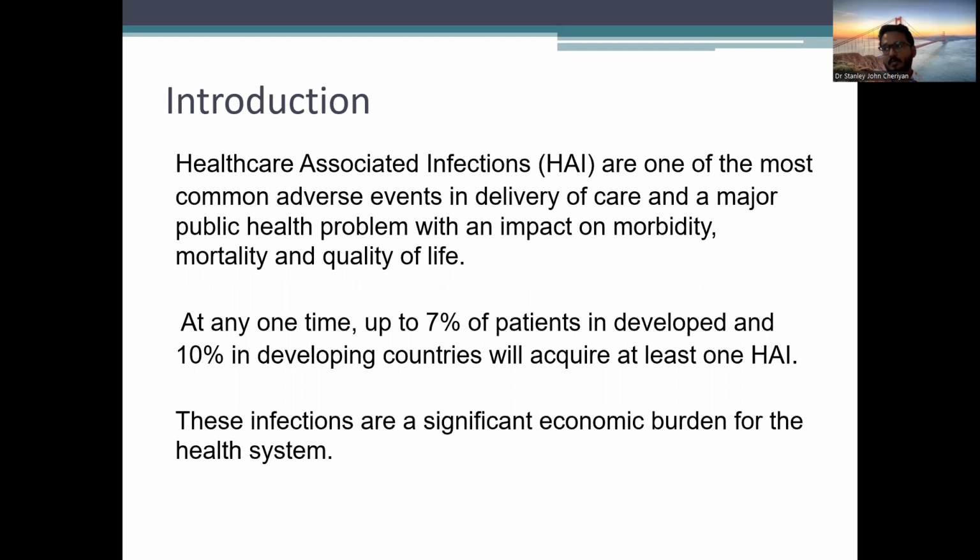Imagine a patient coming to you on the worst day of their life and they have to go home with another infection. That is simply not acceptable. So we have to take sterilization very seriously. Also, these infections cause a significant economic burden for our system.